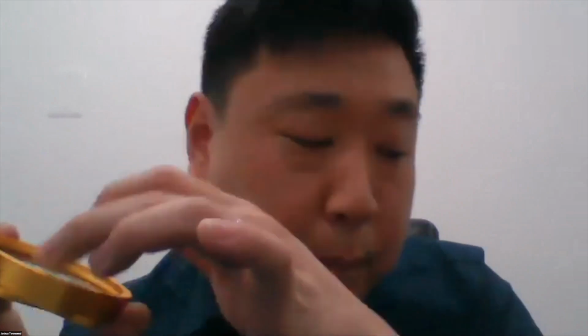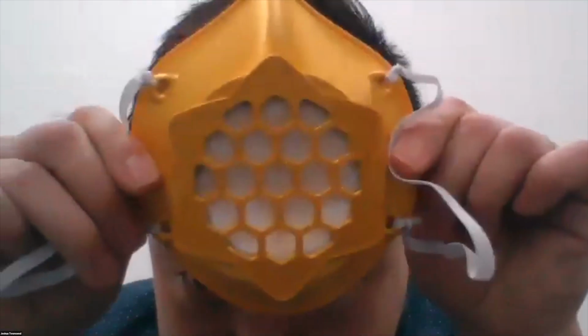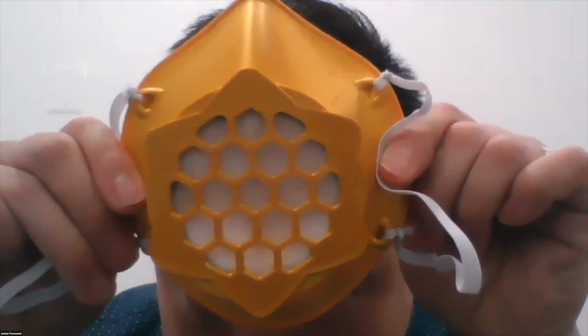After I have the filter on, I'm going to drop the washer in, and that'll offer a better seal than using the cap without the washer. Other than that, that's about it. Pretty straightforward. Everything we wanted to do for this whole mask project was make sure that every process was simplified to its maximum degree.